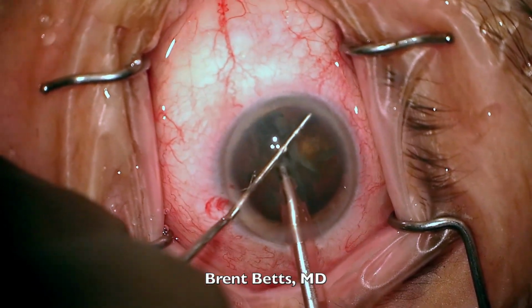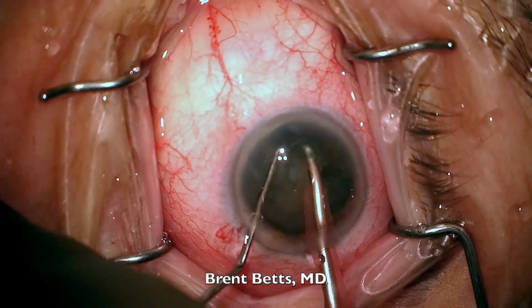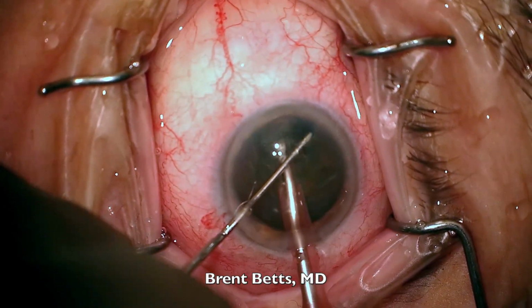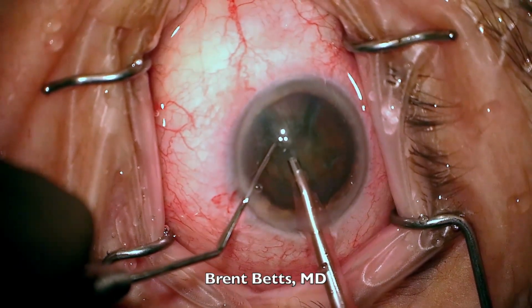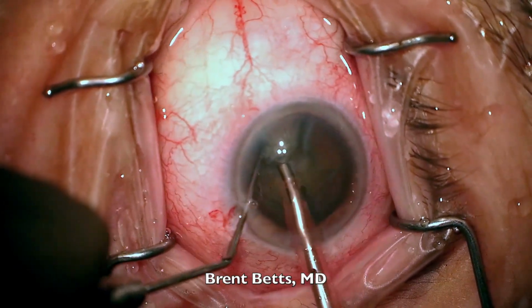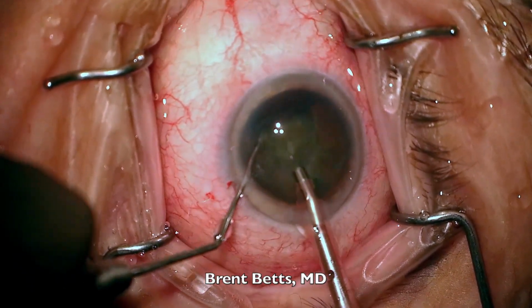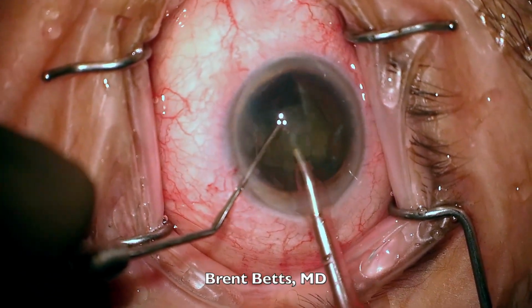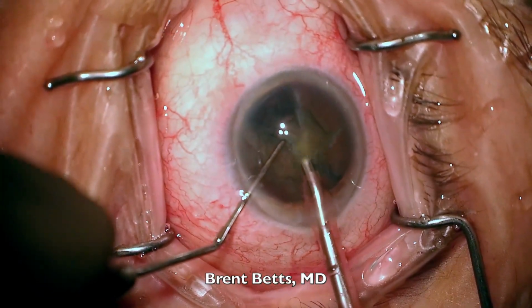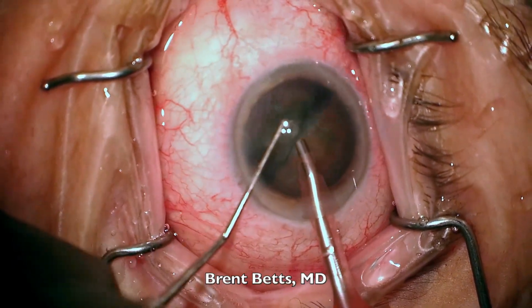Then I will do a cross chop, where I break one of the halves into a smaller segment, kind of like splitting a pie into 4 or 6 pieces. This is where the phacoemulsification probe is used to bring that smaller piece to the center of the eye, where I can use a foot pedal to introduce ultrasonic energy to help break up the cataract into liquid and remove it with a vacuum.